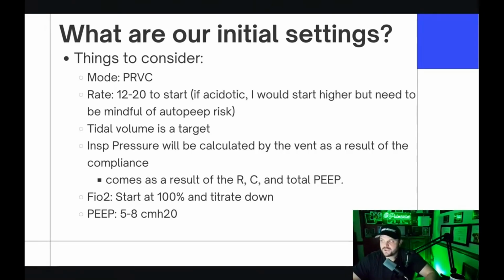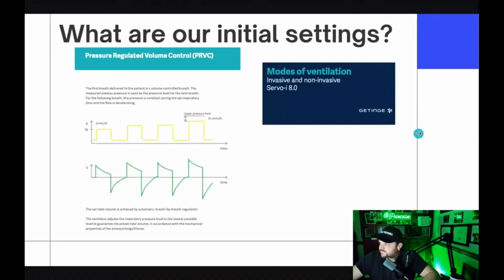But for me, if you have a pneumothorax right now with volume control, in the next breath it's going to need more pressure to get your volume in. And I want to know when there's things wrong sort of right away on the vent. So that's sort of how I approach it. All right, we talked about that.